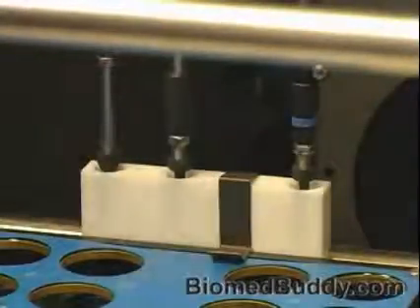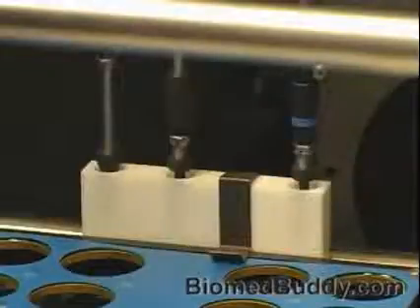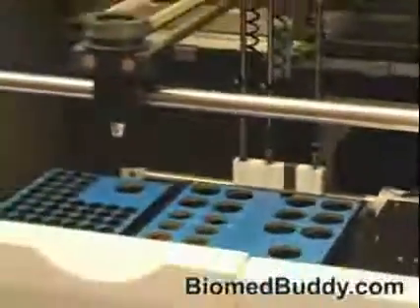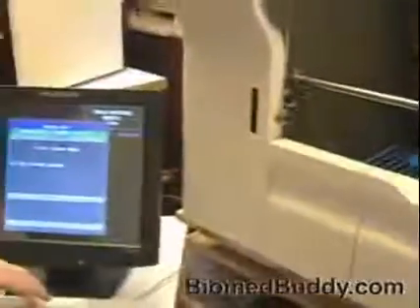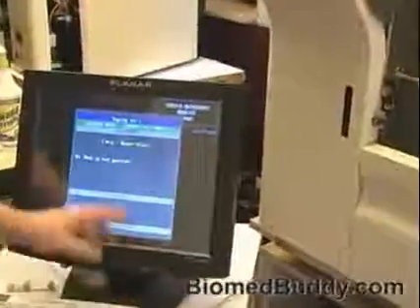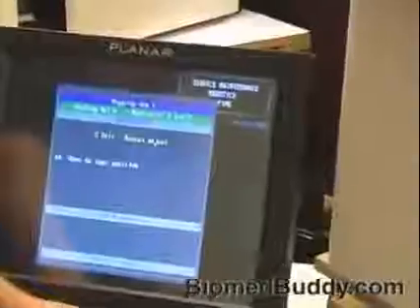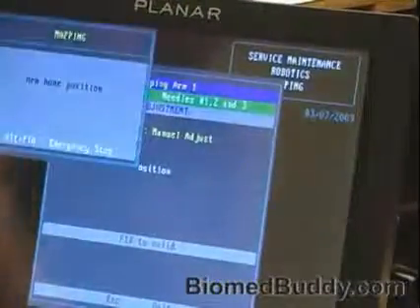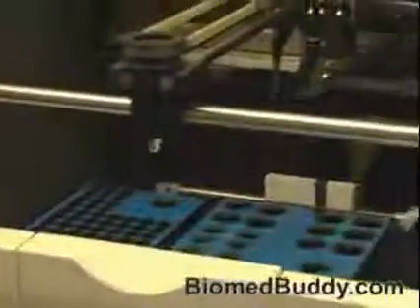Alright, we're good. Now I'm going to go back over to the screen and hit F10. As you can see, it actually says Z movement here. F10 to validate. Now back over to my screen. It all came back up, and now it's 0.